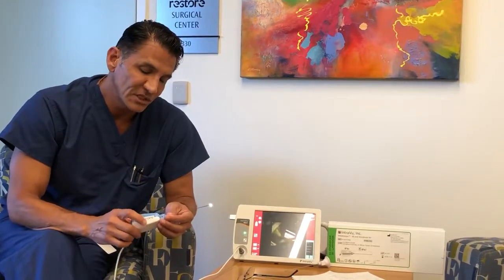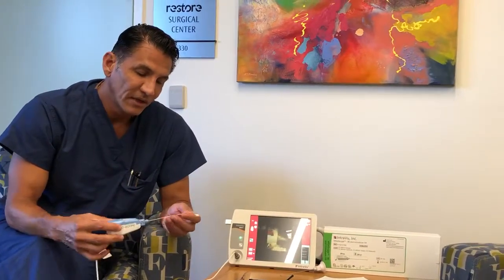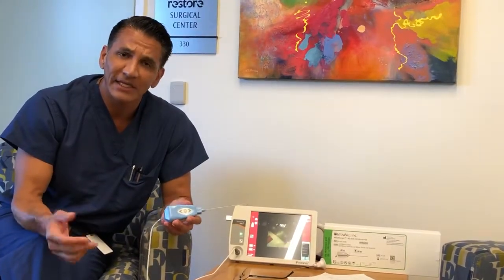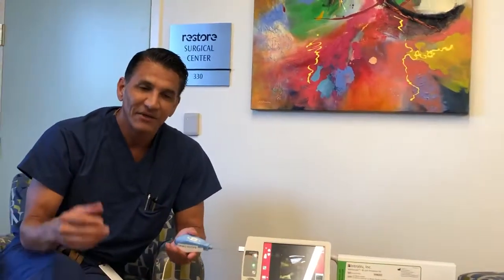And then the last reason that I think this is useful for is a patient that has a positive MRI for meniscus tear. It's an athlete, whether they're a high-level athlete or weekend warrior, but they want to continue doing their sporting activities, and they're not sure whether they really want to proceed with meniscus surgery. Maybe they're worried about the symptoms, and they're wondering if they're causing more damage to the joint. The typical question is, "Doc, am I causing damage to the joint? I know I have a meniscus tear."